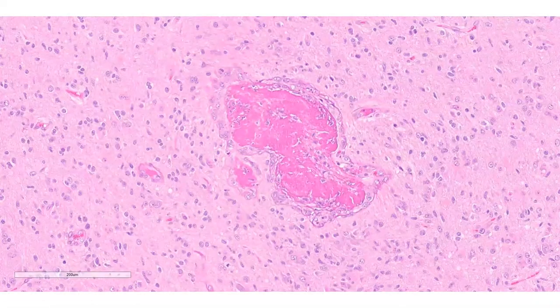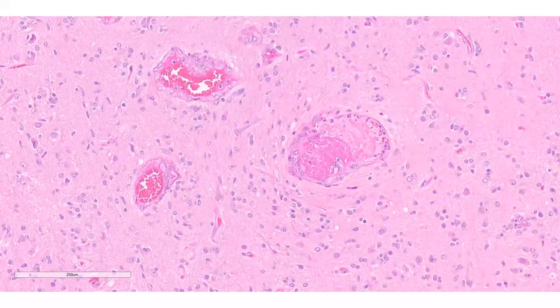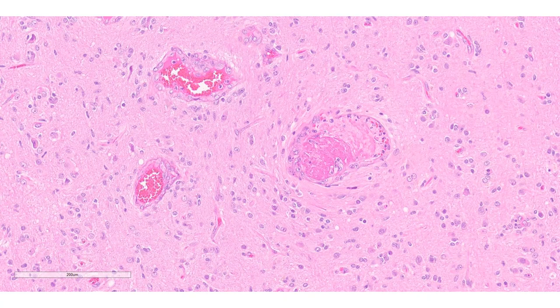All right, this is gorgeous. It's staining particularly intensely. That's why it's the histologic image of the week. Certainly, it's not the only one. Same case. Here's a cluster of two vessels, and it's not 100%. The two vessels on the left, those are red blood cells. There's no thrombus. There's the thrombus, the one on the right.